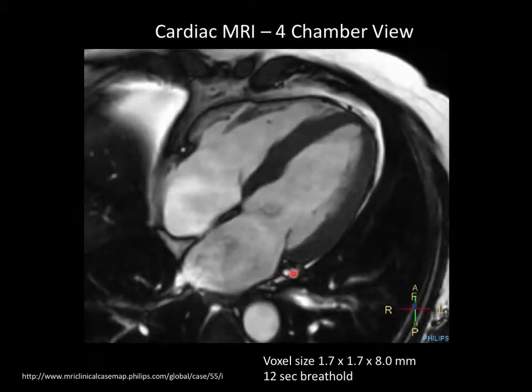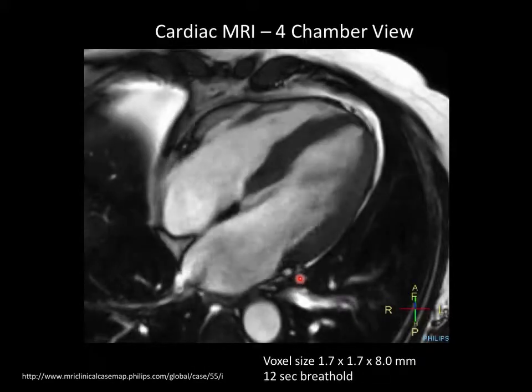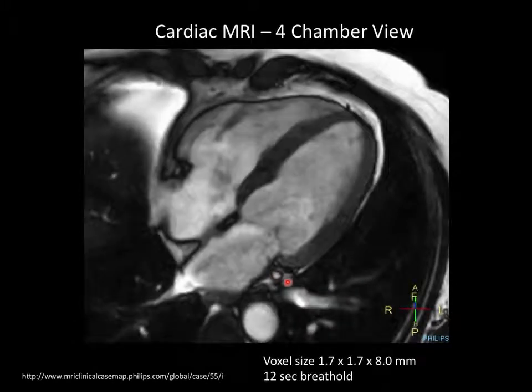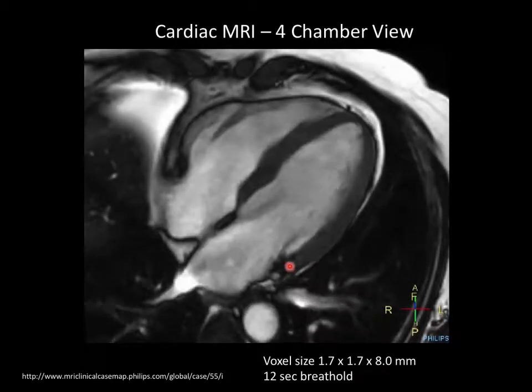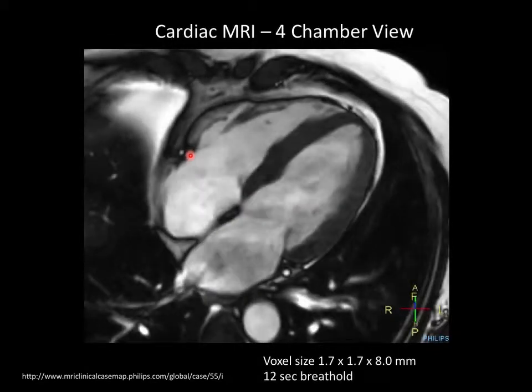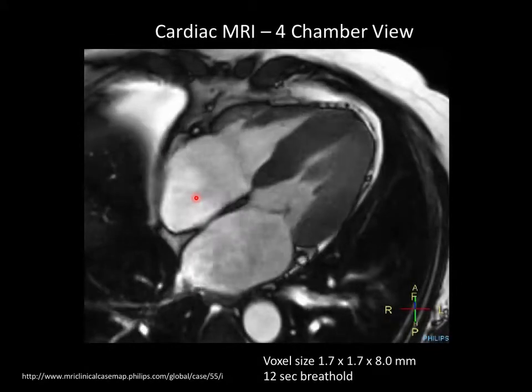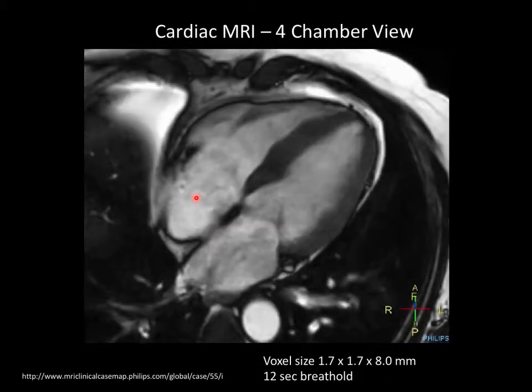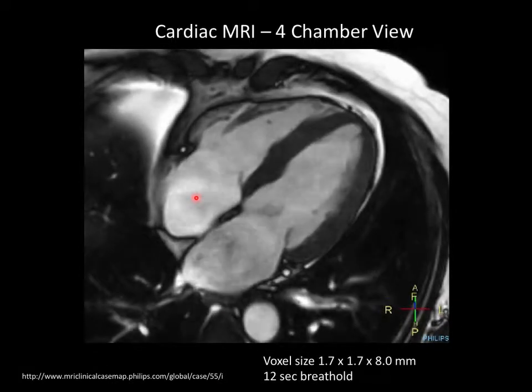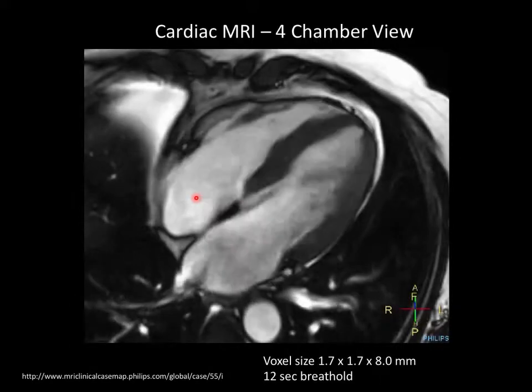Again, here's a large coronary vessel. That looks like it's a cardiac vein, because it's so big, right? And then the coronary vessel would be that smaller signal there. This would be the right coronary artery over here. And so there is hope that you can measure coronary arteriograms and high-resolution pictures with MR of coronaries.